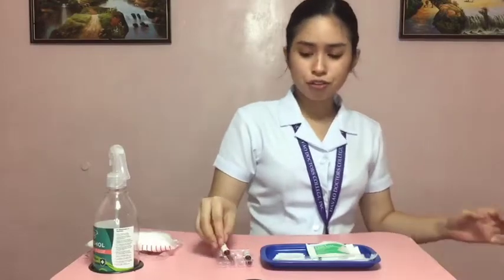So for the intramuscular injection, first things first is to check the doctor's order. Check the medication administration record, and of course, check if the medication being prepared was correct according to the MAR. Now let's first prepare the necessary equipment and, of course, do hand washing to prevent the spread of microorganisms.